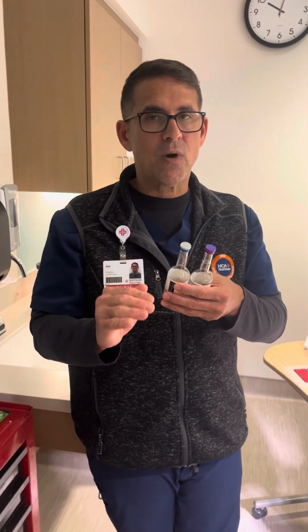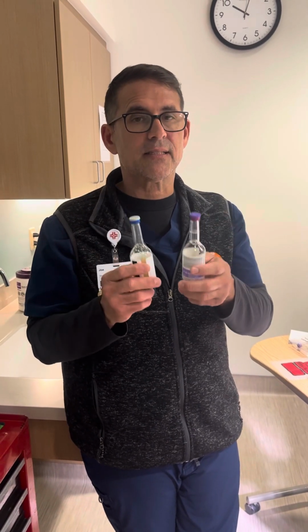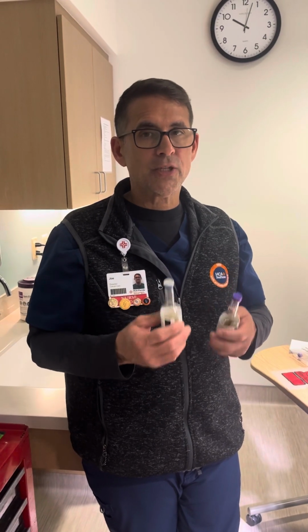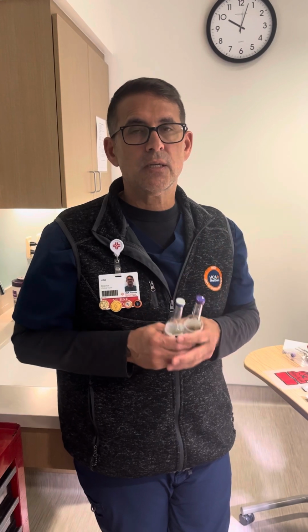I do want you to watch the video that we're going to give you the QR code for, this blood culture draw process. It's a little bit different than the one that we're going to talk about here, but I want you to learn that because we're going to have older kids, and some doctors that say, I want 2 straight up regular blood culture sets, and so sometimes you're going to have to do these.